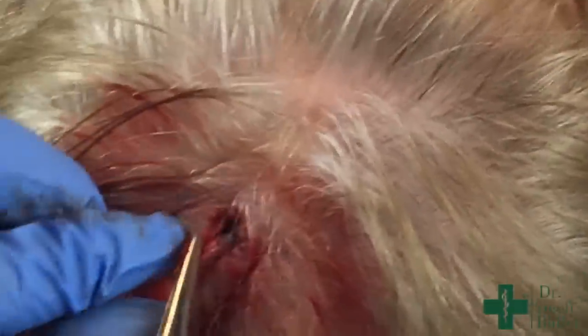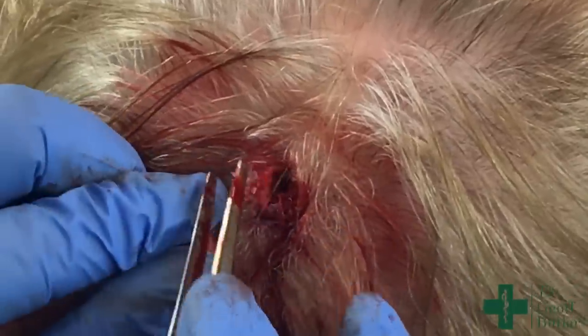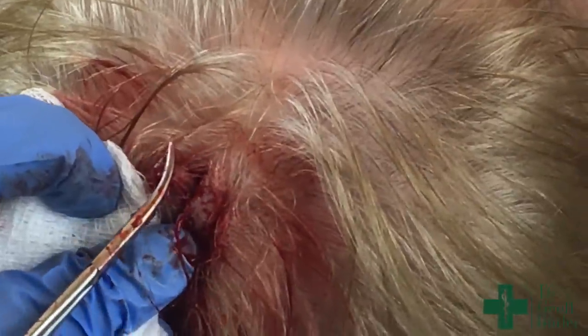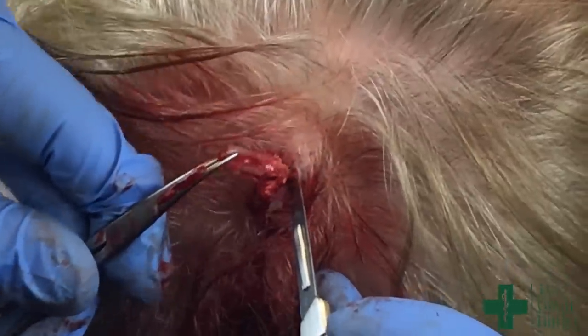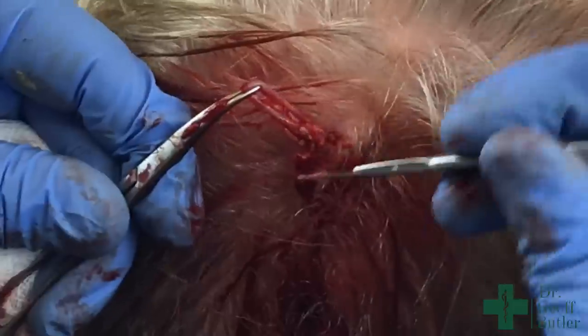So you can see here — this is a secondary capsule that's behind. So when that first one came out nicely, behind that there's another capsule that we're taking out now, so we'll want to make sure we make the effort to get that out. If we don't get this out, she's just going to have a recurrence. So hers was truly loculated — or two separate cysts. You can see that's all capsule.